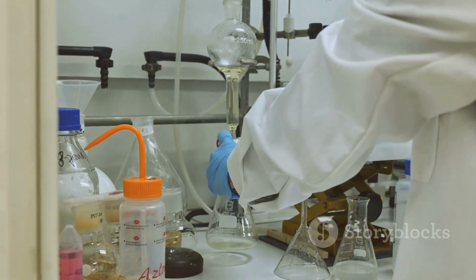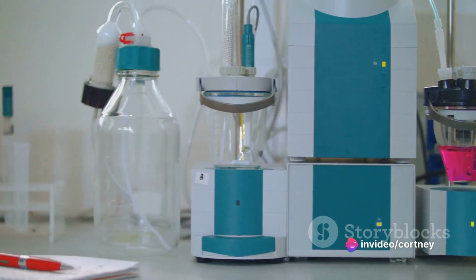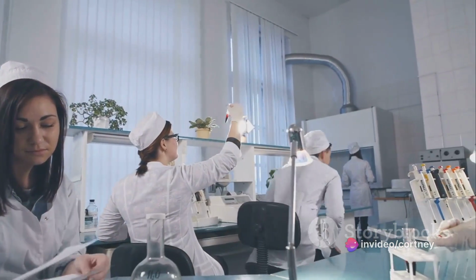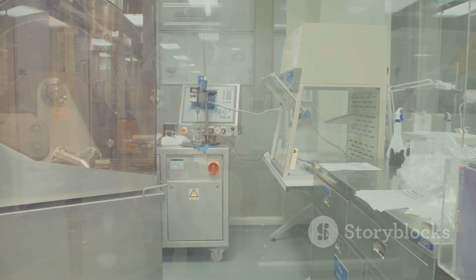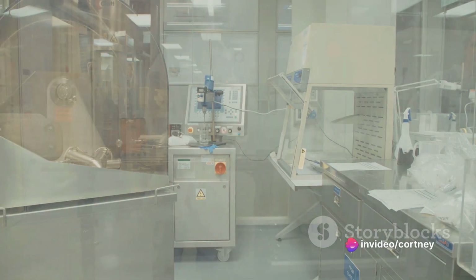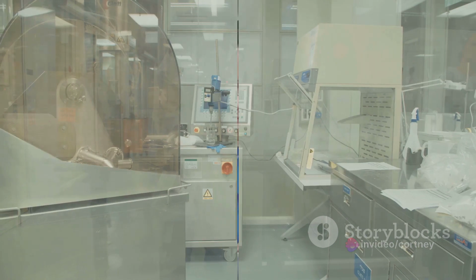The time it takes for a compound to travel through the column from start to finish is its retention time. Each drug or metabolite has a unique retention time, much like each runner has a unique running speed. This unique characteristic allows us to identify the specific drug or its metabolite in the sample. With the help of gas chromatography, we can confirm whether a positive result from the immunoassay test is indeed accurate.